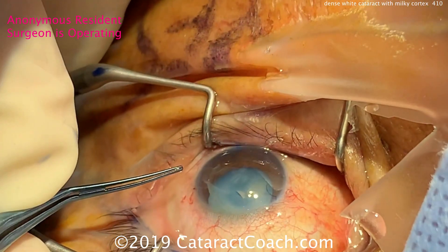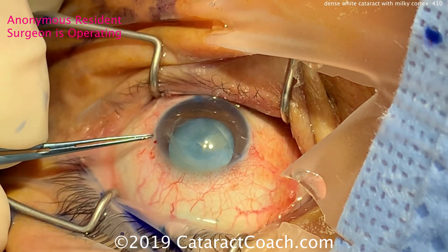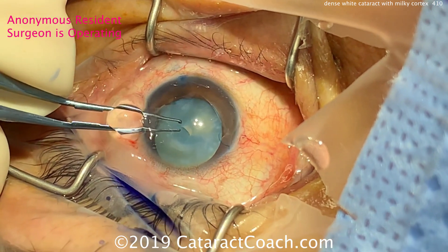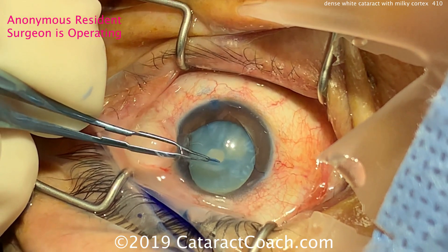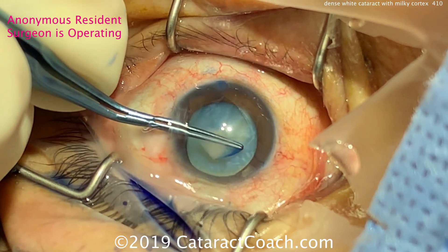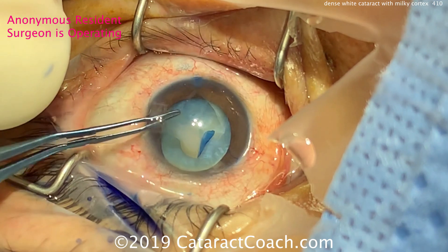The resident here is operating under topical anesthesia. The patient is having a little bit of a hard time fixating, and the resident has made the main incision and already used a cystotome to open the central lens capsule. As the forceps are grabbed and the rhexis is beginning to turn, you can see there is a lot of egress of milky fluid coming from the capsular bag out into the anterior chamber.